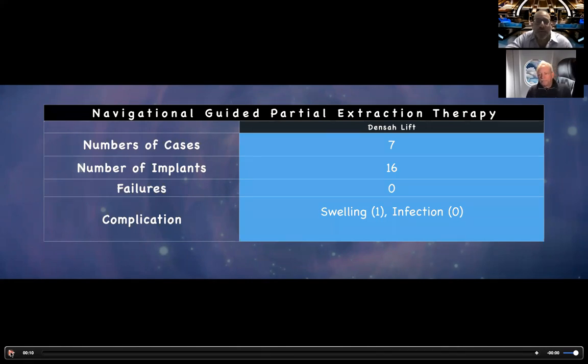Now, to me, is the time to get into this before there becomes so much information that you're caught behind. It is getting easier and easier to use. It's now very kind of foolproof for the most part. But it's the time to get in. If you haven't been involved in this already, it's the time to get in, for basic implants, for full arch implants, for cases like this of socket shielding, root membrane, or for sinus lifting, and for many other different types of techniques.